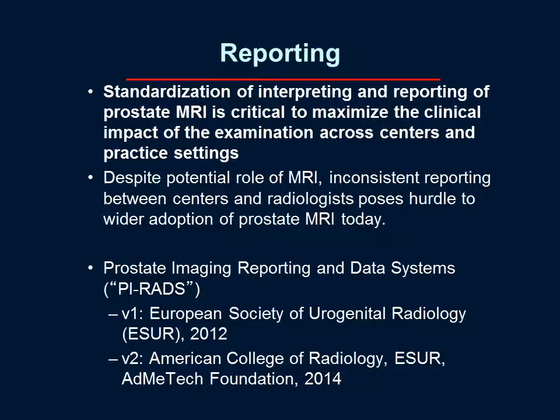So moving past interpretation and now into reporting. Standardization of interpretation and reporting of prostate MRI is critical to really maximize the clinical impact of the exam across centers and practice settings. Despite the role of MR, it's really been inconsistent reporting between centers and radiologists that has been a major hurdle to wider adoption of prostate MRI. And we're now really getting beyond that and having solutions to this through the use of standardized reporting systems.